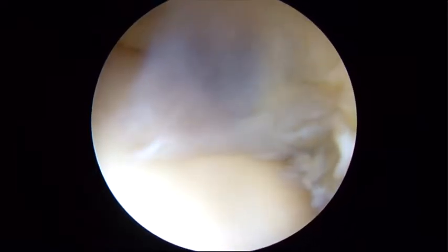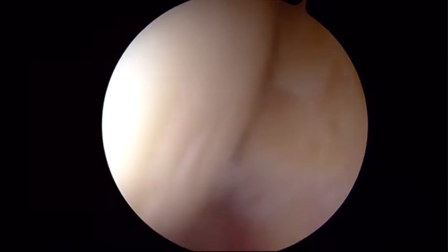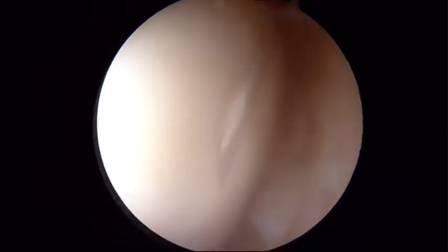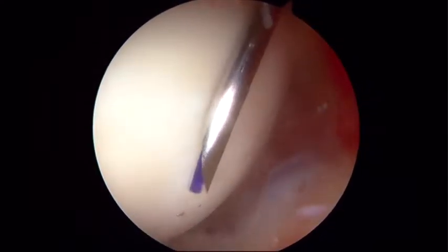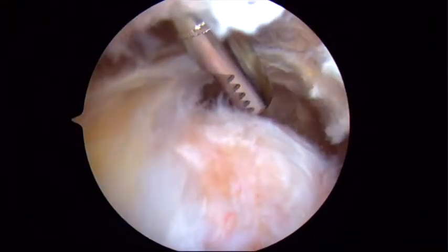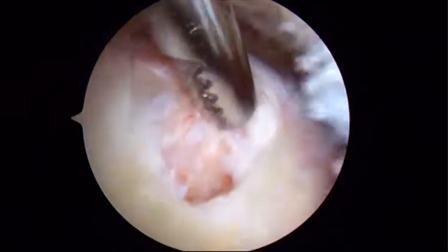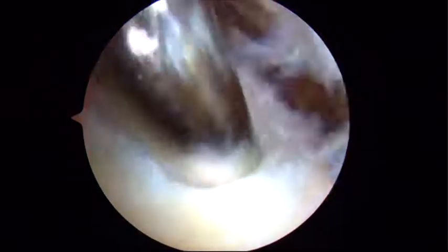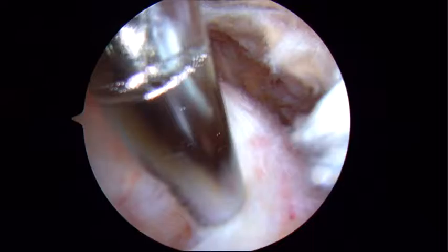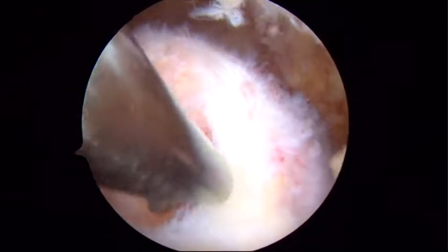And then more superiorly, we'll look up to our supraspinatus tear. These minimally displaced tears sometimes can be hard to spot from the bursa, so it's always best to mark these so you can see what it looks like on the bursal side. We remove the marker here, and the first step is to debride enough bursa so you can see this tear.